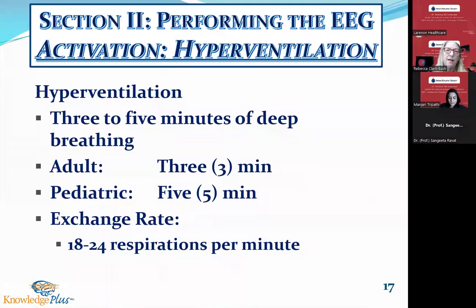Number one, their academic performance starts to fall. So they start to not do as well in school, because to that child, having multiple episodes a day is very similar to you talking on a cell phone, and you can only hear every other word. So that to the child, their consciousness in, consciousness out, they can't really benefit from lectures if they're happening multiple times a day. So with the 5 minutes, I will perform 5 minutes. And if there is no abnormality at the end of the test, I repeat that 5 minute hyperventilation.